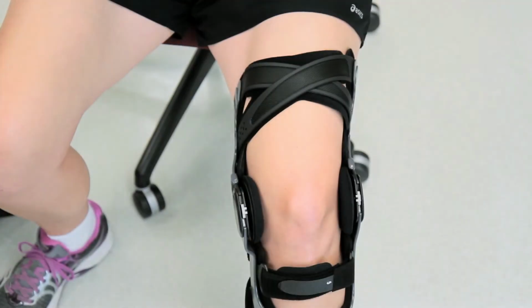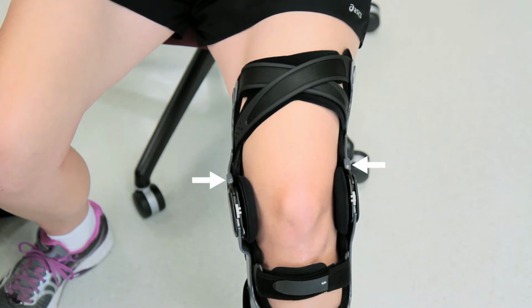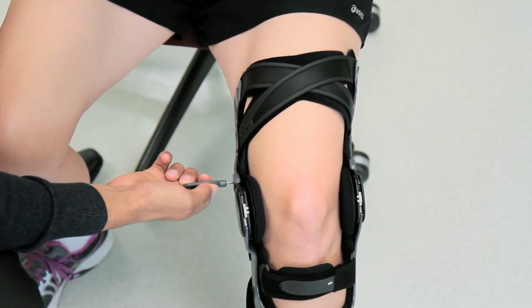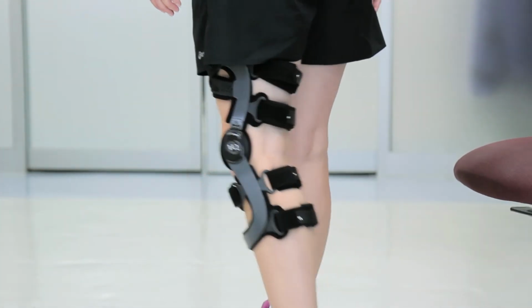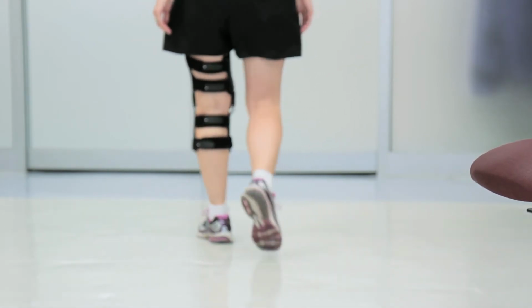Braces should first be adjusted to neutral. This means that the angle of the brace should follow the same lines as the patient's leg, even if the patient has a bow-legged, varus, or knock-kneed valgus deformity. On either side of the brace are hinges called Q-hinges, which change the angle of the brace. Insert the patient adjustment key into each side and turn until the brace is lined up with the patient's leg. Have the patient stand up and walk around to make sure the brace is comfortable and that they do not feel any pressure on either condyle pad.